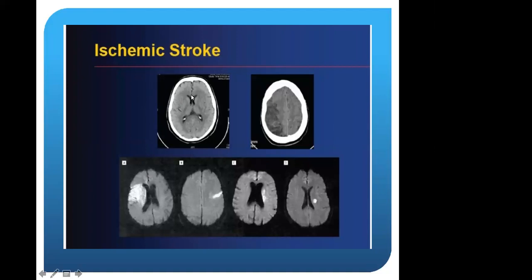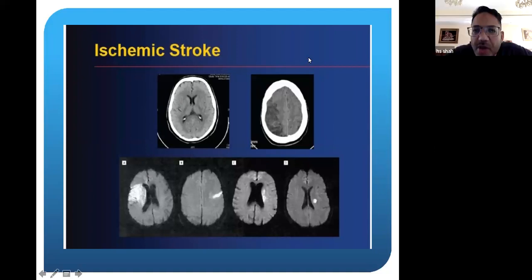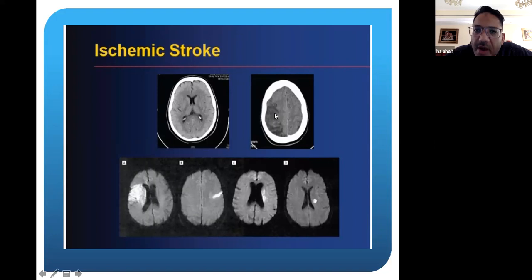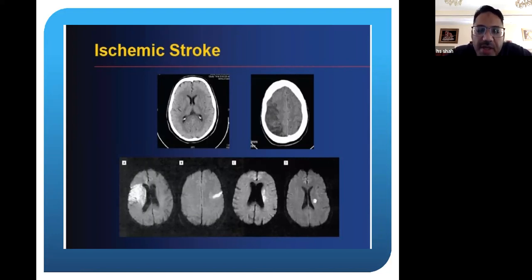If you see the first top images, these are CT images. The first image is not really showing signs of a stroke, but the second image shows some signs. You can see this border here — this is an arterial type border where the middle and posterior circulation arteries are affected. This is an area of infarct. These are diffusion images, and diffusion is very sensitive for early stroke. CT may not be sensitive for early stroke, but MRI is very sensitive. These are MRI diffusion images, and where you see bright diffusion, these are signs of stroke.